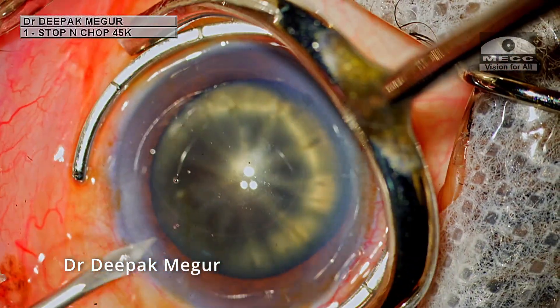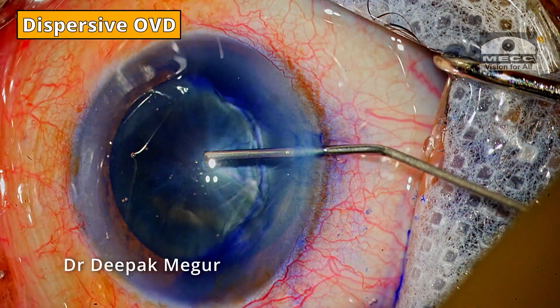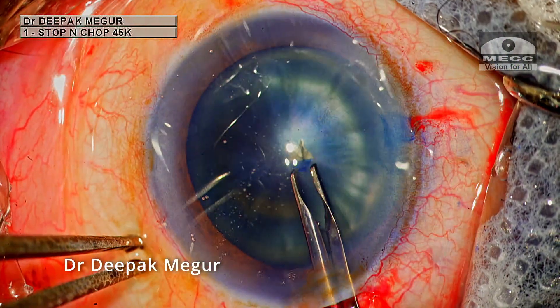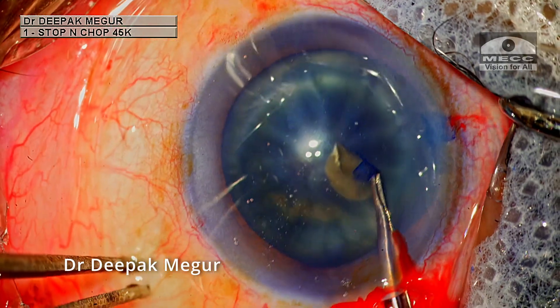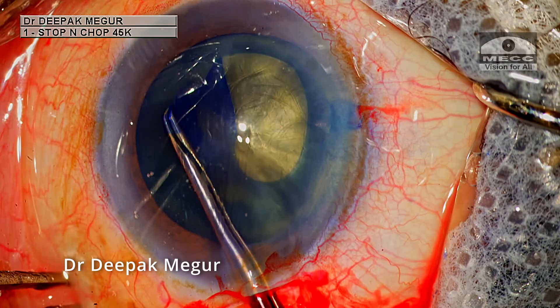The side port incisions are created. The capsule is stained and I'm using dispersive OVD to deepen the chamber. The rhexis is being performed with the forceps. In these hard nuclei, it's important to have a larger rhexis as it makes the manipulation of the nuclear fragments easier and also less stressful on the capsule bag.